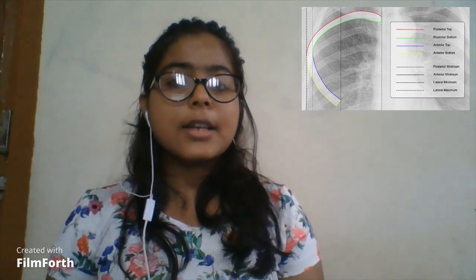Two-dimensional chest radiographs are most common for diagnosing pulmonary diseases. These are widely used because they are inexpensive and they expose patients to less radiation in comparison to 3D CT scans. However, these are very limited in nature as they only give the 2D view of the patient's data.